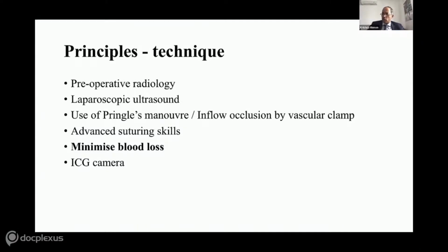The first case I'm going to talk to you about, and important things that I always do in terms of my resections. All my resections are done using an Olympus 3D system with split legs, as shown by Nilesh earlier. I use 5 ports for major hepatectomy, 3 times 12 ports, and 2 times 5.